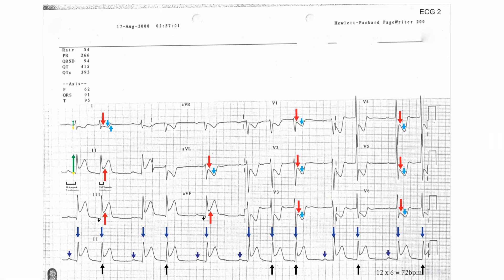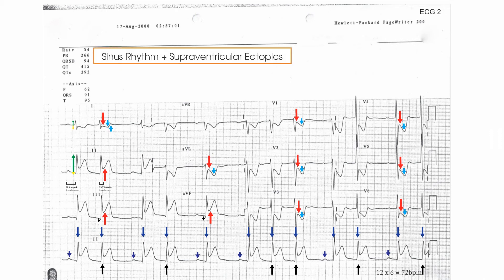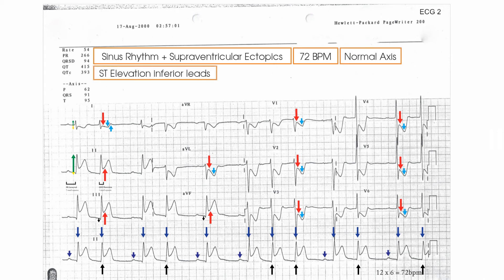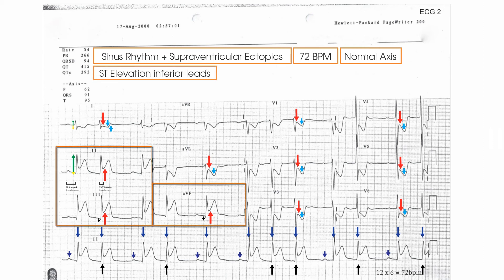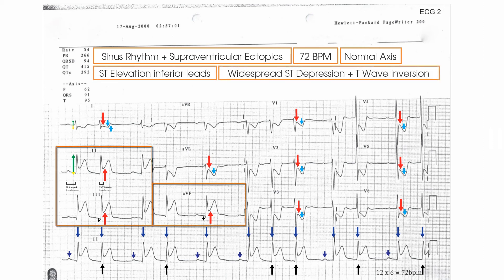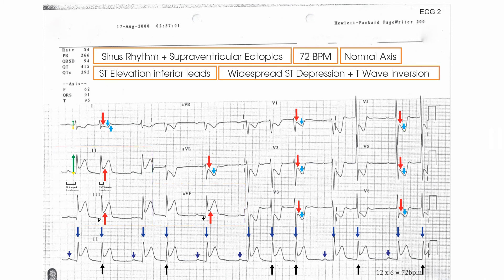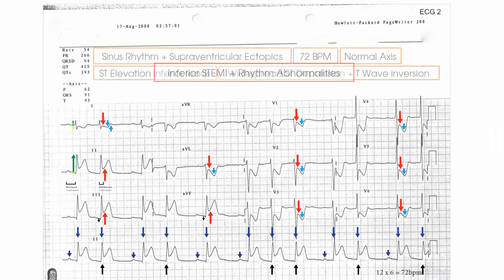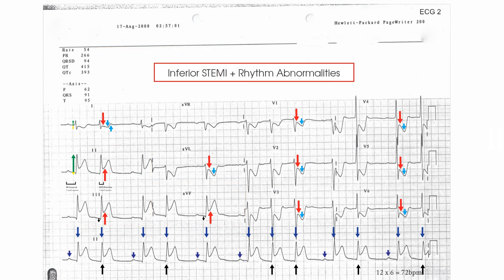In summary, this ECG recorded from a patient with chest pain is in sinus rhythm with supraventricular ectopics at 72 beats per minute with a normal axis. ST-segment elevation in the inferior leads and ST-segment depression with T-wave inversion throughout much of the rest of the ECG would suggest that the patient is having an ST-segment elevation myocardial infarction, complete with rhythm abnormalities.